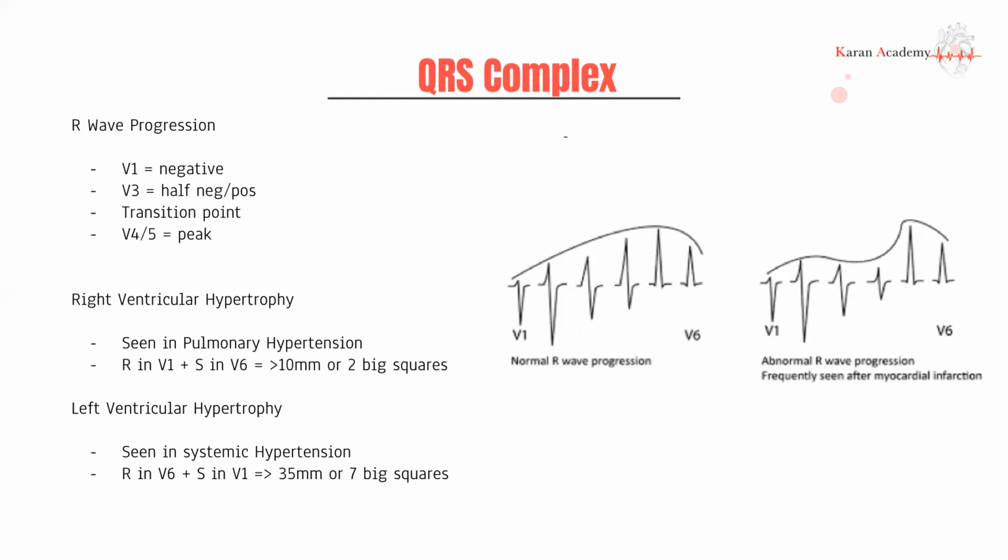I shall move on. Now, let's say we have left ventricular hypertrophy. I know I have right first. I'm sorry, but let's talk about left first. If you have left ventricular hypertrophy, if I were to ask you, random person listening to this right now, would we expect the R wave to be taller in V6 or V1? Just based on what we just said.